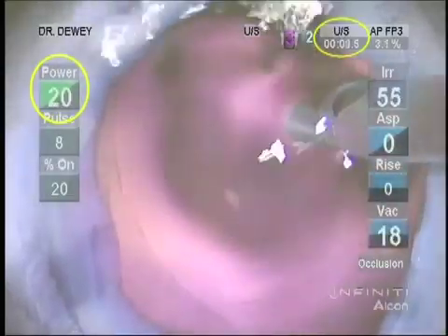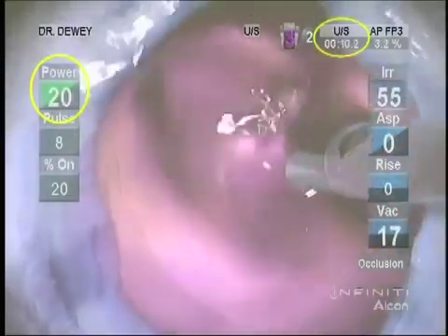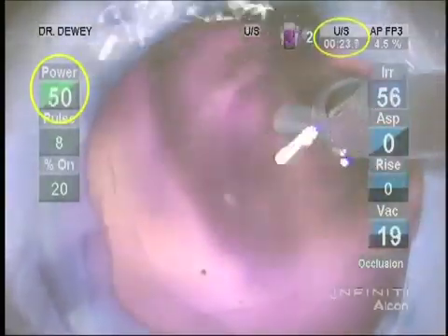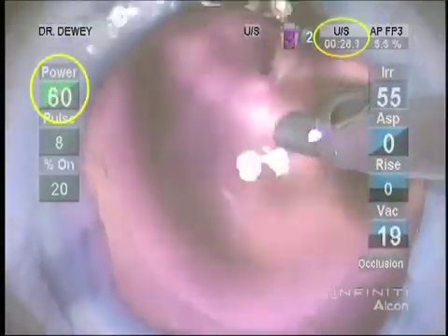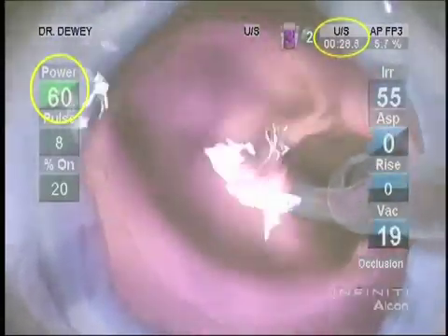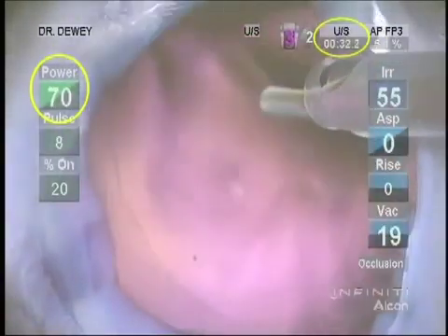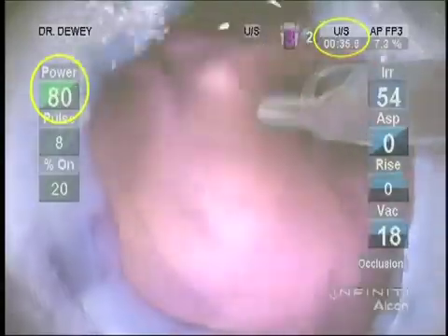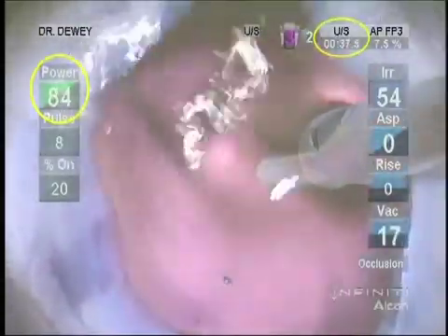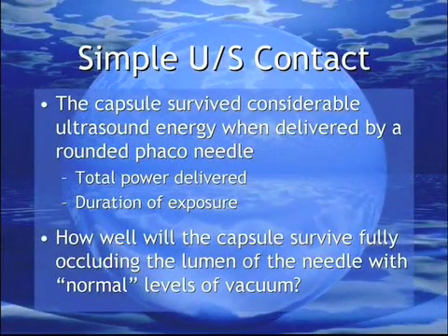A very brief segment of this has been shown previously. This time, a longer version better shares my continued amazement with the safety of this tip. Quite honestly, I was expecting this capsule to burst like my child's helium balloon against the ceiling light fixture with the briefest touch of ultrasound. With the cornea removed and with pressure against the globe to push the posterior capsule into an accessible position, I stroked the capsule with the rounded needle. The capsule did not break with simple ultrasound contact until 83% power was reached and over 38 seconds of FACO power had been applied to the capsule in this area. The tensile characteristics of this capsule survived considerable contact using a rounded FACO needle in active ultrasound, both in regards to total power delivered and duration of exposure.